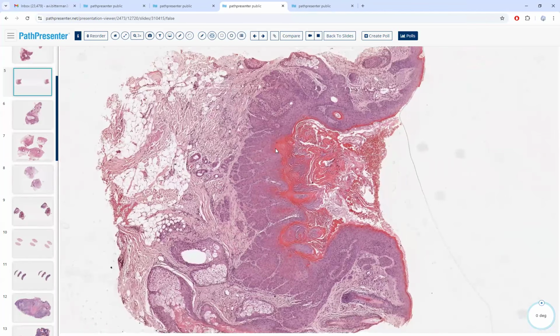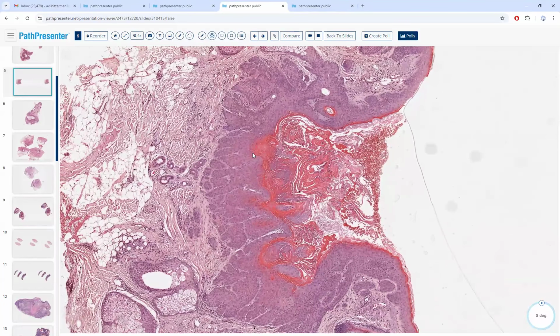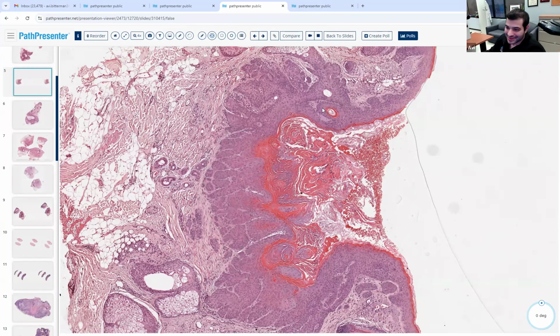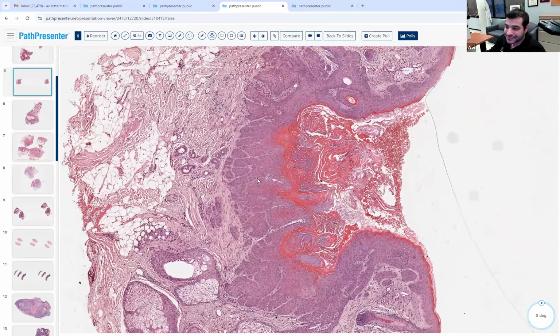I think the pilar sheath acanthoma has thicker acanthosis change, yes, the bulbosity, whereas the dilated pore of Winer has just that thinner reedy pattern. Okay, so we recognize that there's a pore, and we recognize that it has a reedy structure to it. So we have that differential. Which one is it?